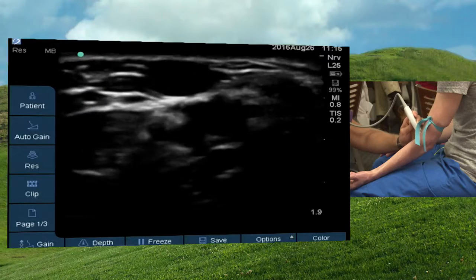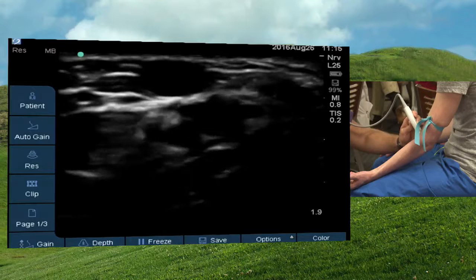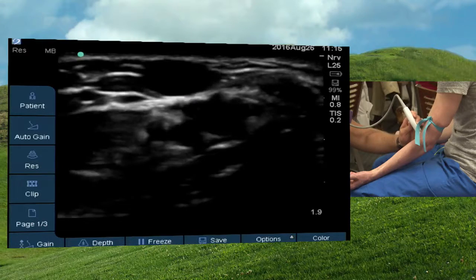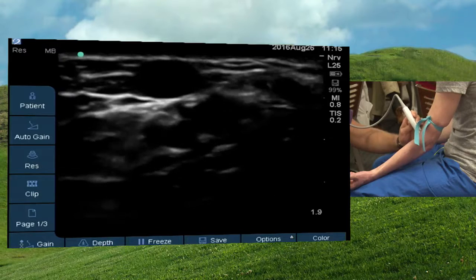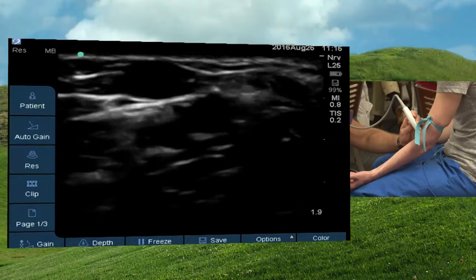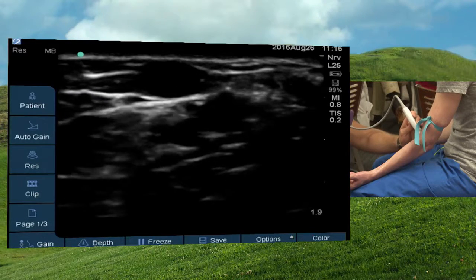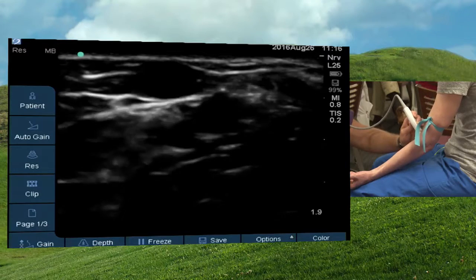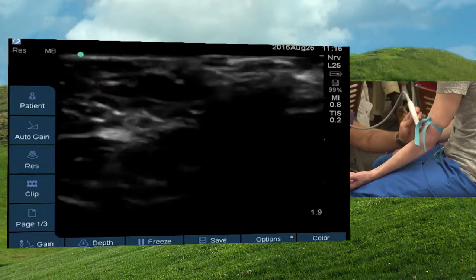And you would approach it the same way you'd approach any vascular access. In this case, I almost always approach in a short axis out of plane view. And you just do like always. You put the needle in, you'll be able to watch it appear on the right or the left or in or just above the vein, and look for the flash in the hub of your IV start kit, and go ahead and thread the IV.